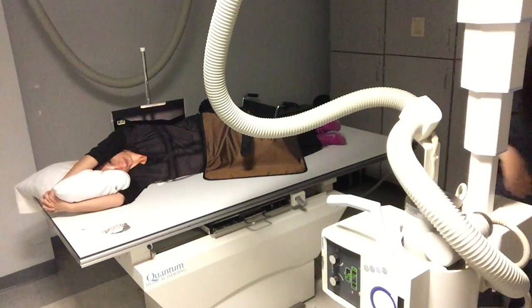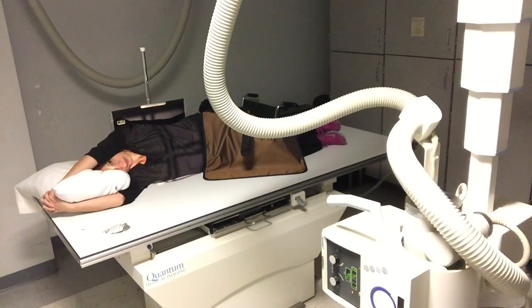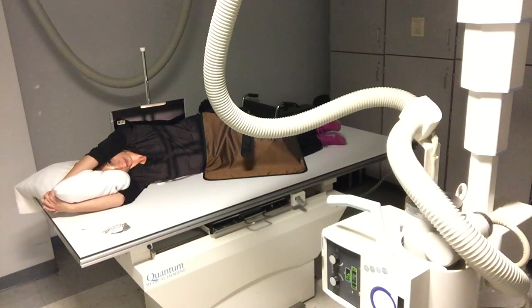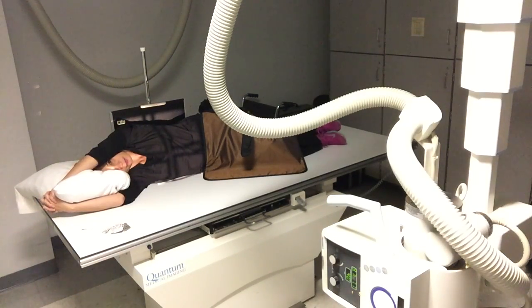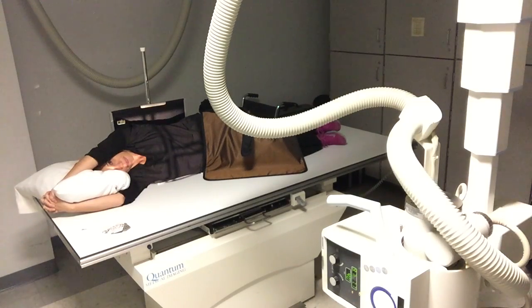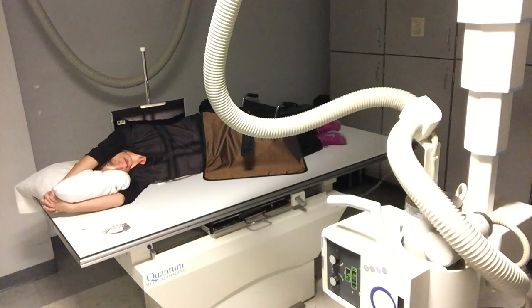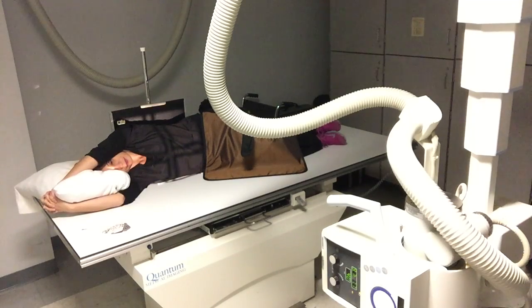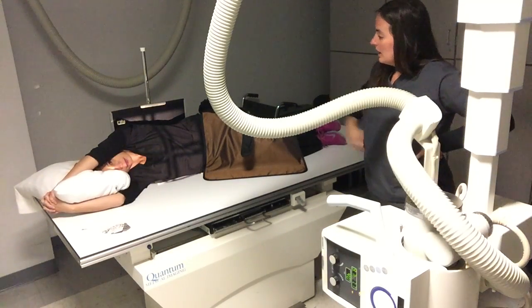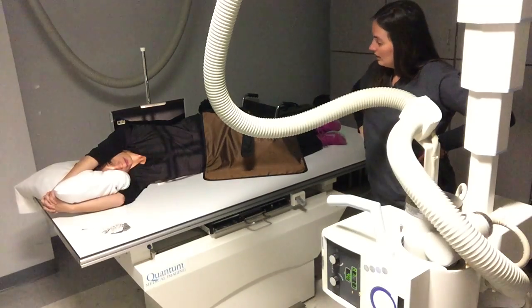This is exactly like an AP chest — I'm going to set my kVp at 120. I'll have her take in a deep breath, blow it all out, take in another deep breath, and hold while I make the exposure. Since we're looking for air and fluid to settle on this film, we usually like to have the patient laying like this for about five minutes before we take the exposure.